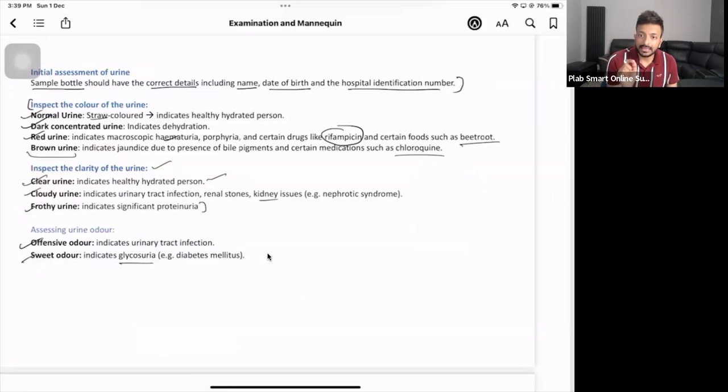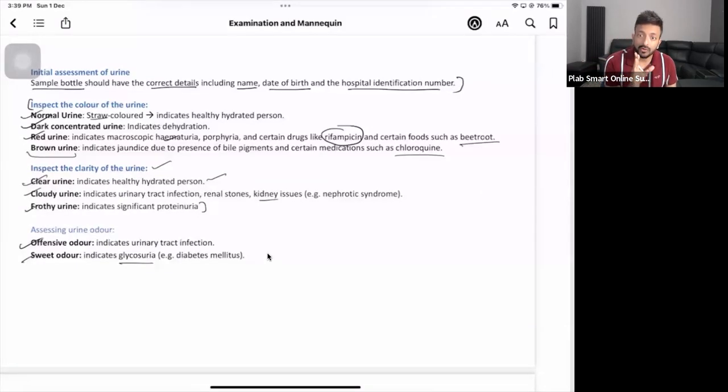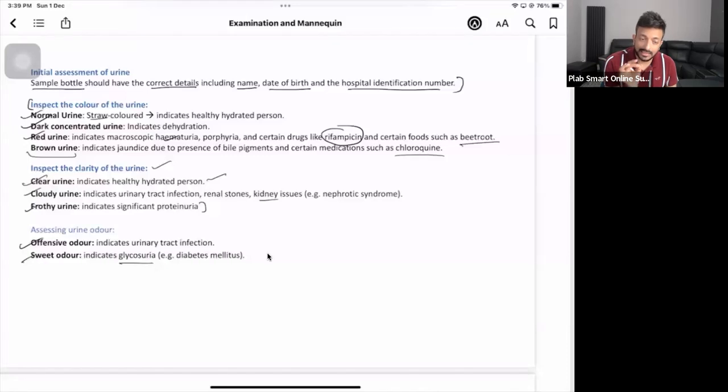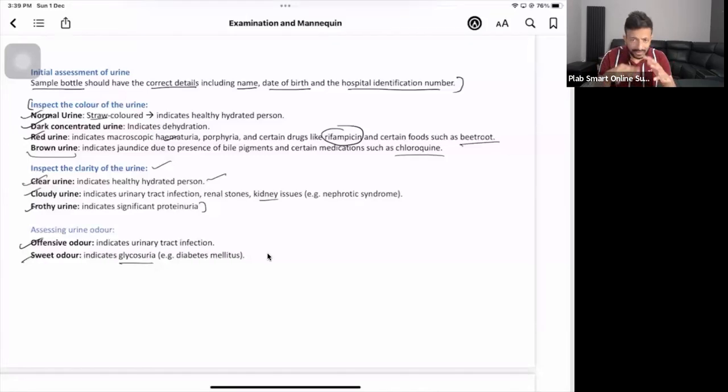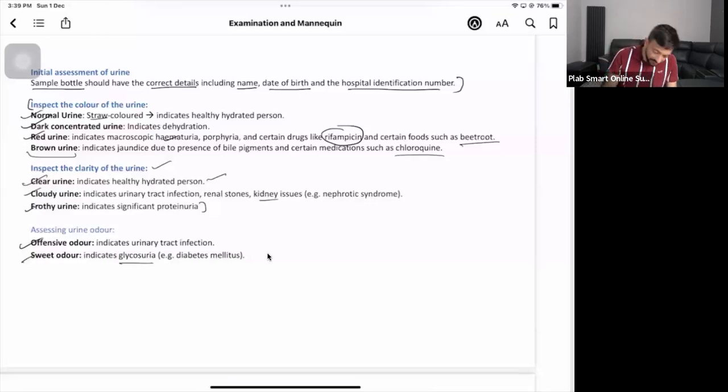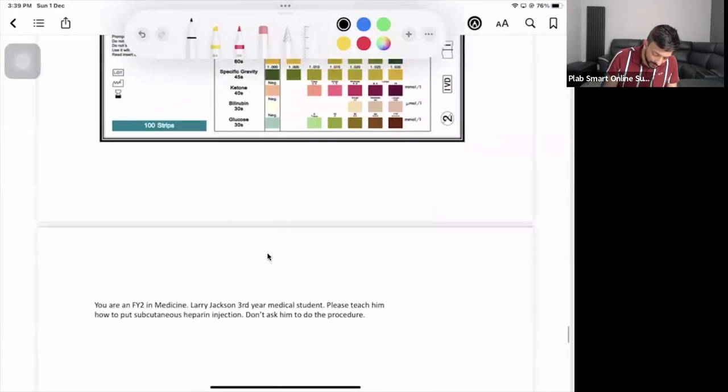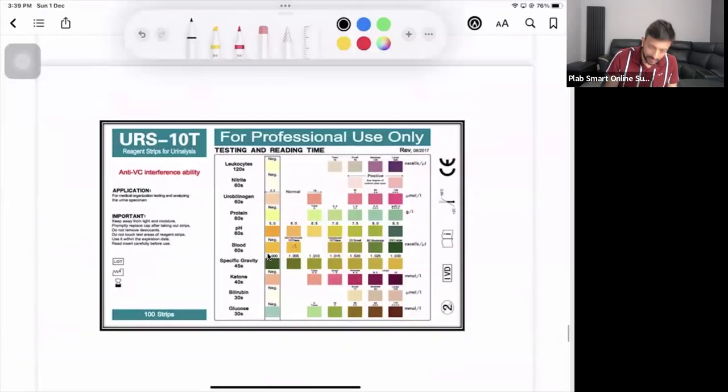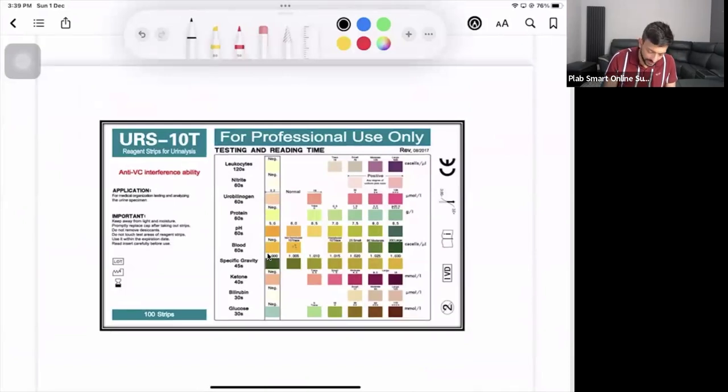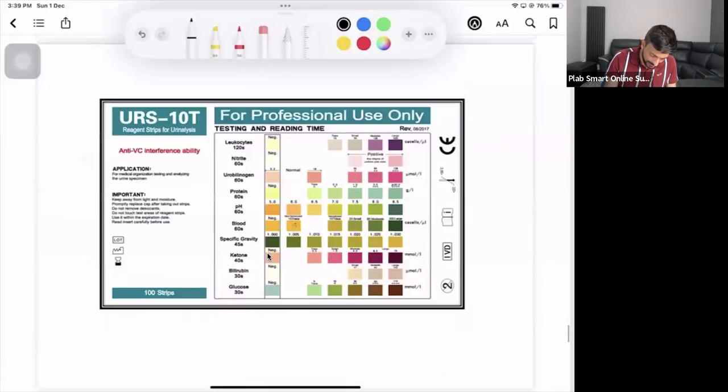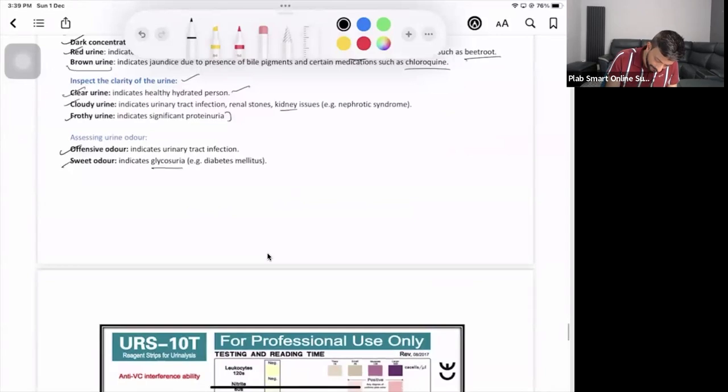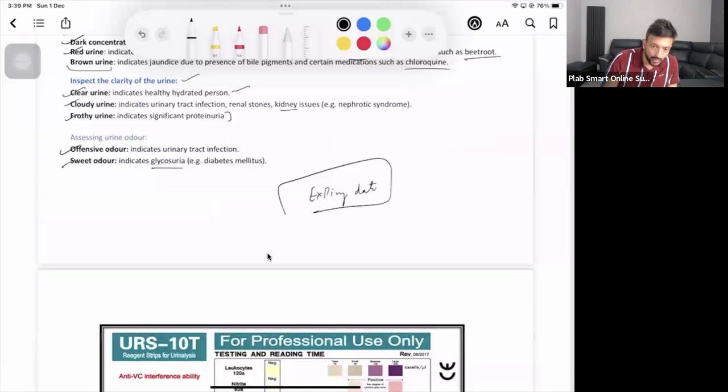You've checked the identity, you know it's midstream urine, you've built a rapport, then you check color, clarity, and smell. All these processes will take maybe three to four minutes. Then you'll have a urine dipstick bottle - check the expiry date.